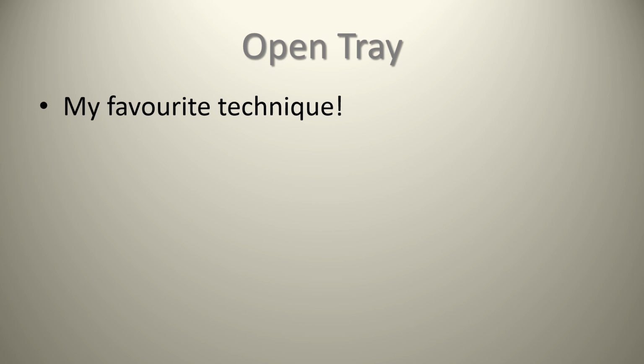And as you can probably imagine, there was a tremendous lab error in using that technique. And so I had to break the news to him, saying, okay, well, this is a different type of closed tray technique, not something which I would necessarily advocate or try to teach on my course. And so I had to try to convert him over to using the open tray technique. So it is my favorite technique. Yeah, it's a little bit more difficult. It's not quite as easy as, say, the closed tray technique, but if you want something that's going to consistently give you accurate results, this is something that I have found in my practice works fairly well.